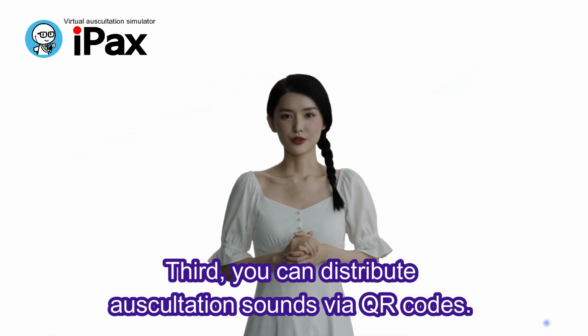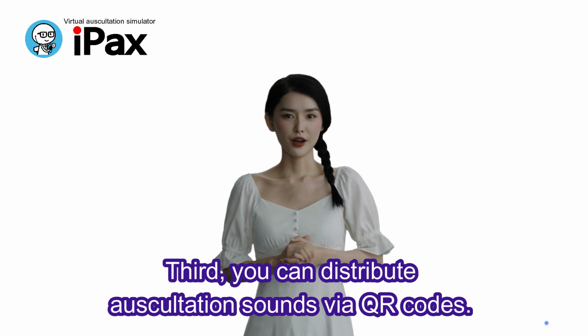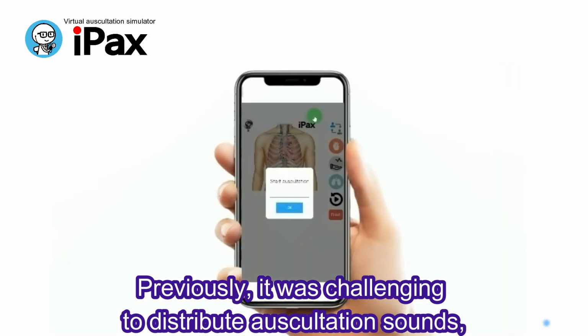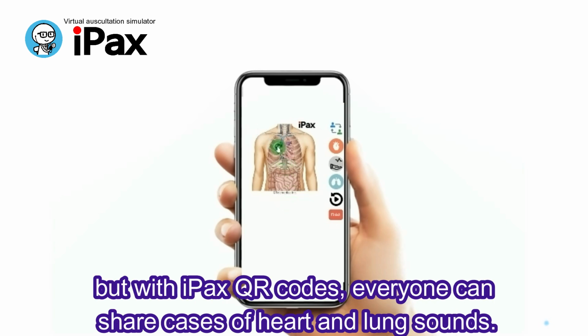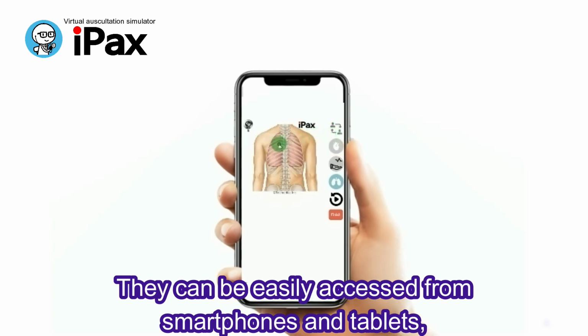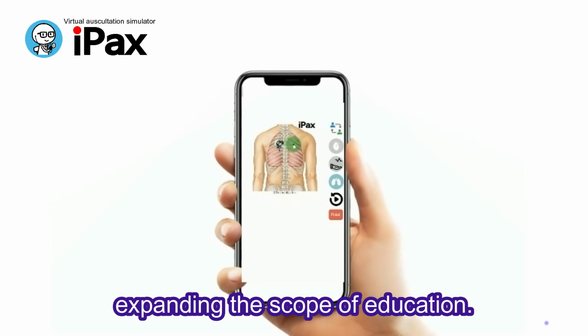Third, you can distribute auscultation sounds via QR codes. Previously, it was challenging to distribute auscultation sounds, but with iPax QR codes, everyone can share cases of heart and lung sounds. They can be easily accessed from smartphones and tablets, expanding the scope of education.